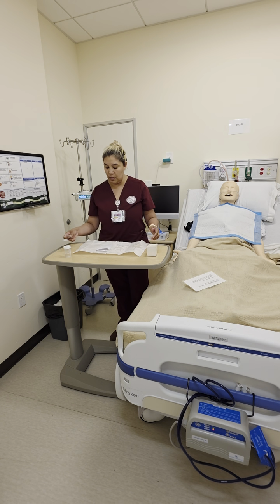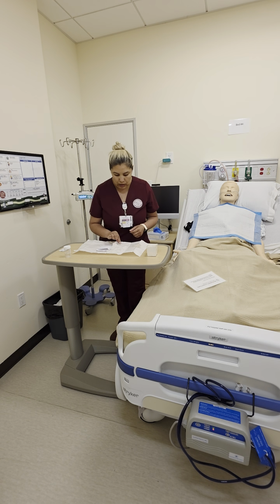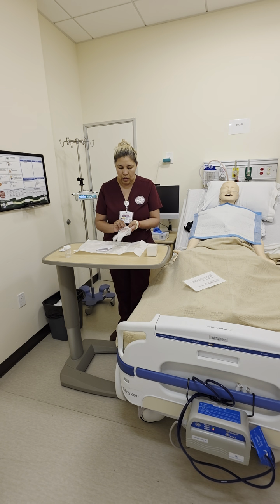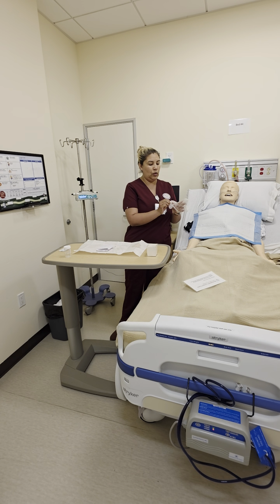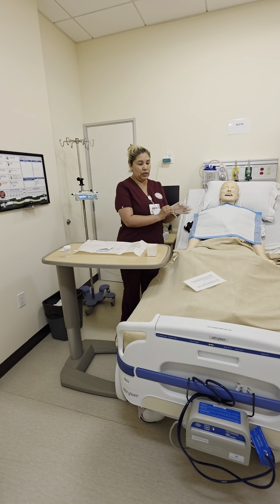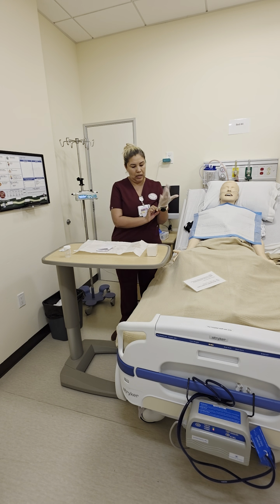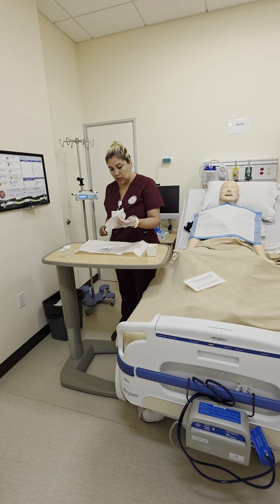Before I put on my gloves, I'm going to put KY jelly, and put on my gloves. For pharynx suctioning, I'm going to go in 3 to 4 inches. For tracheal suctioning, I'm going to go in 8 to 9 inches.